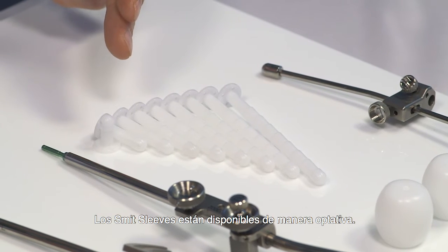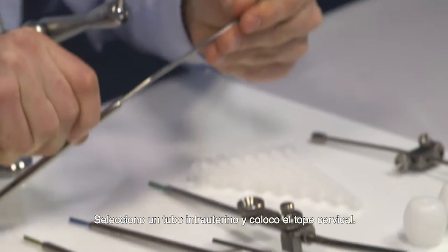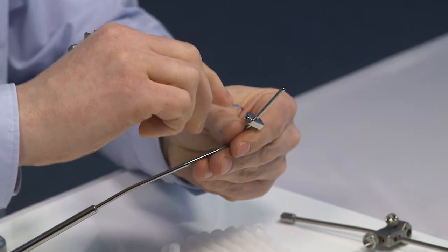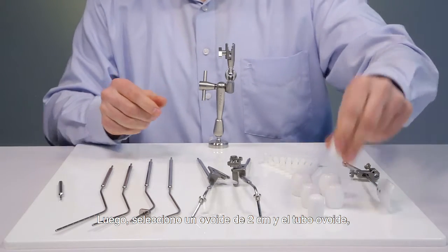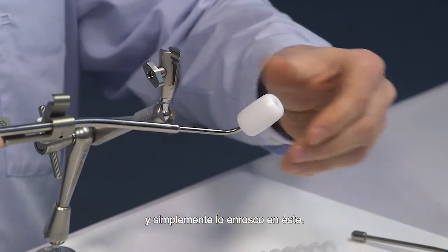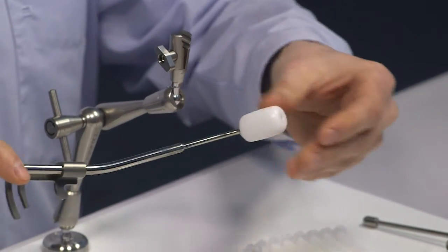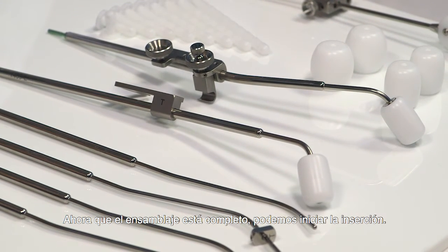Smit sleeves are available as optional items. Now let's start with the assembly. I select an I.U. tube and fix the cervical stop. Now I select a 2 centimeter ovoid and the ovoid tube and simply screw it on the ovoid tube. Now the same for the left channel. The assembly is now complete and we can start the insertion.